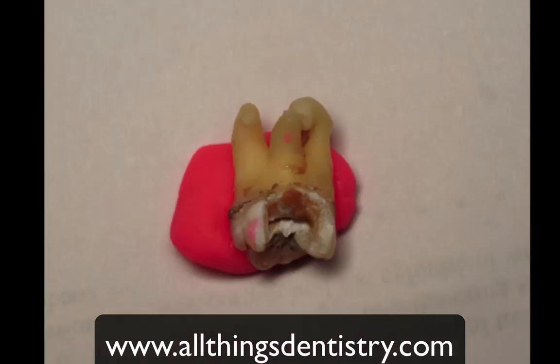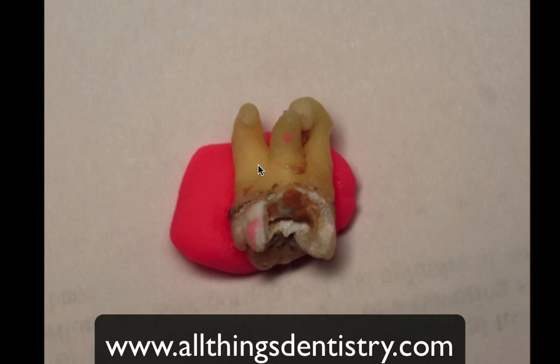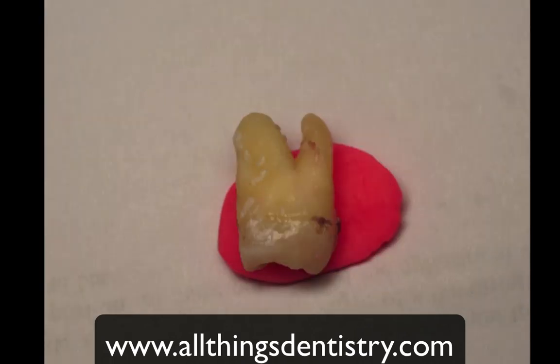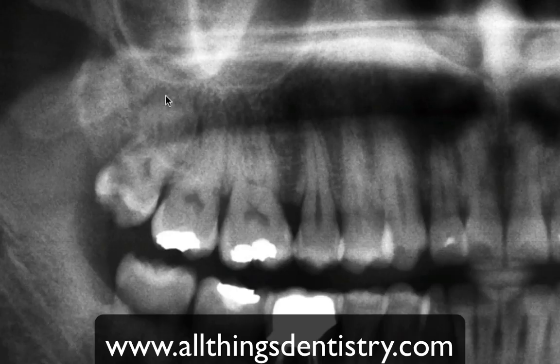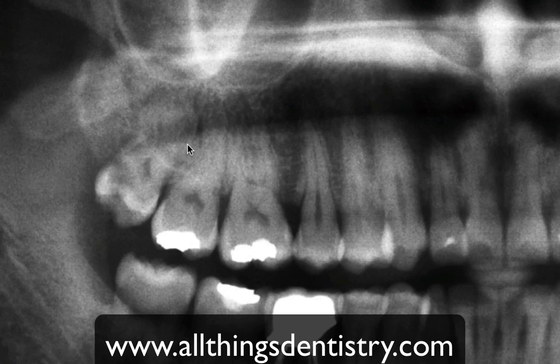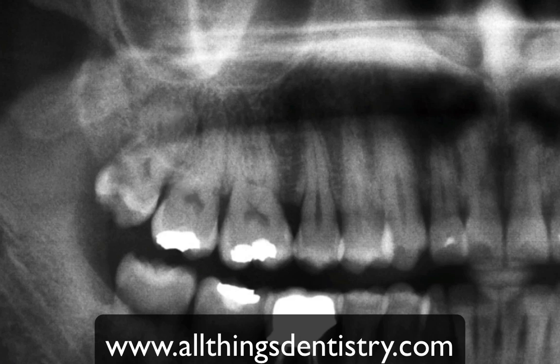Here's the view from the buccal, and here's from the distal. The key point is to go slow because you'll break those things off. The biggest learning point: look at the apex. If you have defined roots, you're good to go — you have a pretty good idea. If you don't, go slow, give it time, and with experience you'll get those out no problem. Hope that helps — cheers.